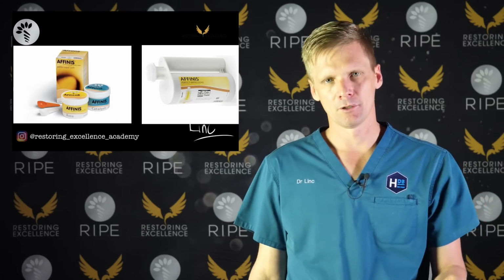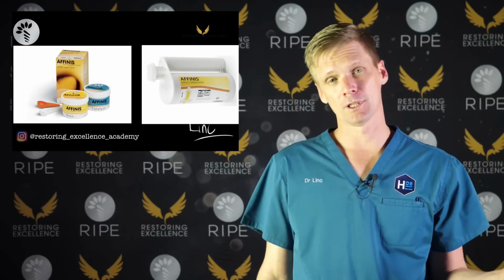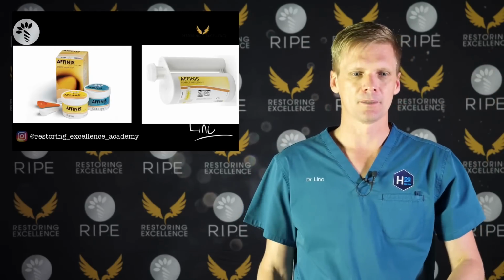You can use whatever material you are comfortable with. Just don't use materials where the heavy body is really runny. It has to be quite stiff, otherwise it will not push things in.